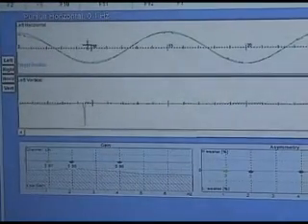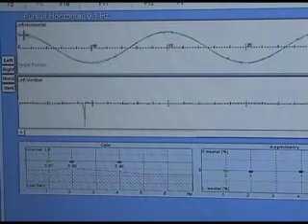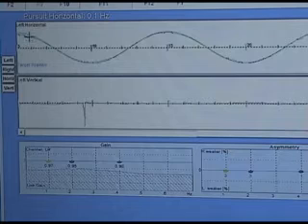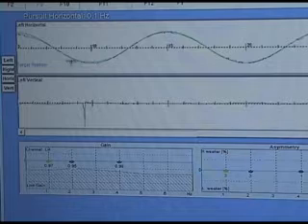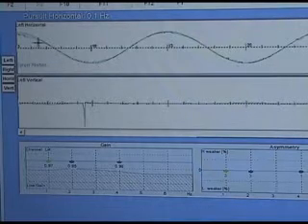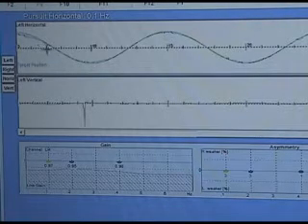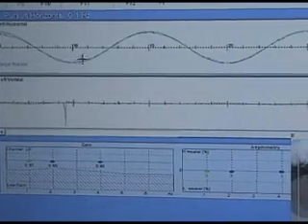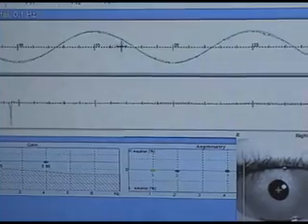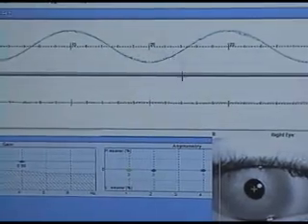And so with this, we should see that the patient follows the ball with a pursuit mechanism, so they stay right on. You may not be able to see the color, but the blue is normal, the green is the patient, and anything that's off is the red. So this is a normal patient. As this person did this test, he stayed right on the target.